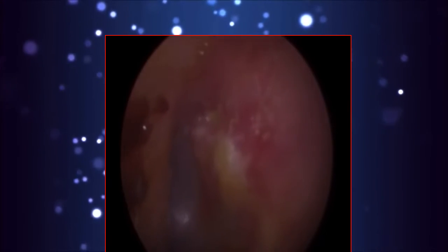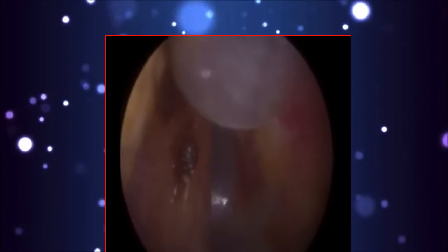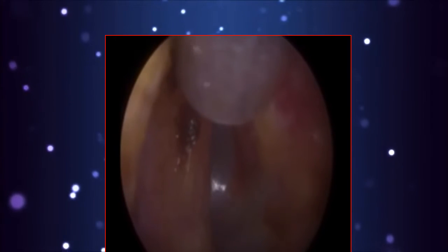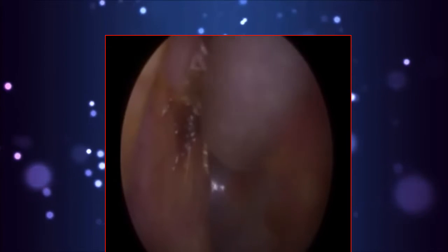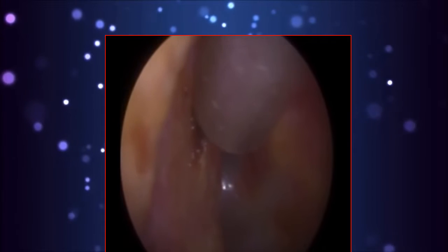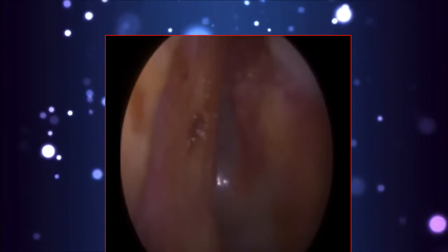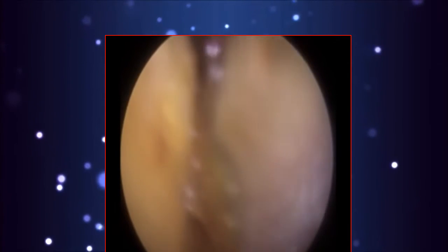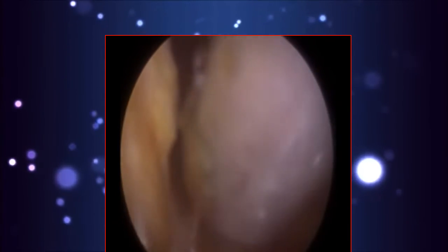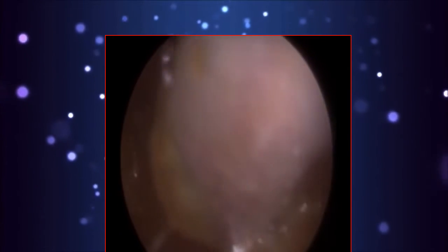There we are, I've got all the wax out. You can see the tympanic membrane, the eardrum, just some residual wax on the anterior canal wall, so that means the front part of the ear canal. Just have to be very delicate, so it's a bit of skin actually, a bit of keratin that's oxidizing, it looks like earwax. I just want to really avoid making direct contact. The eardrum's visible, so posteriorly on the eardrum there's some dead keratin that's forming. You can see a yellow patch, that's fine, that will naturally shed.